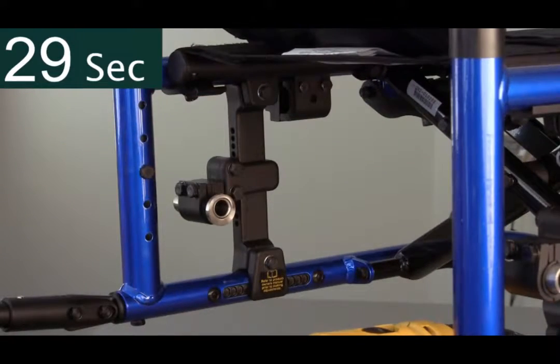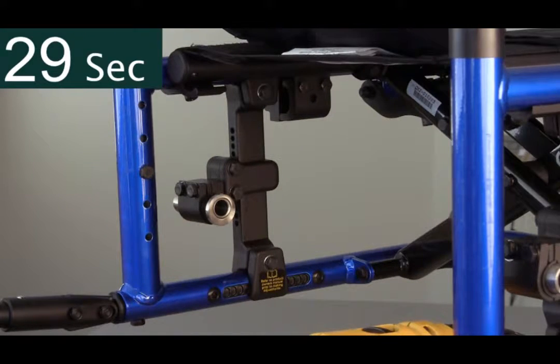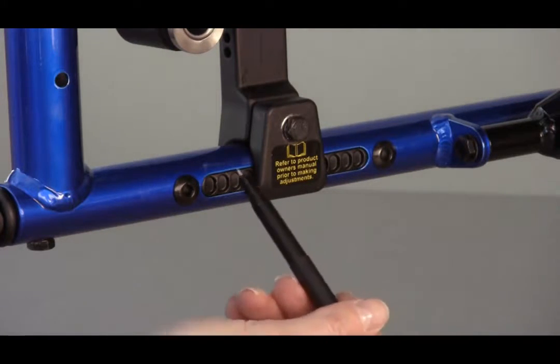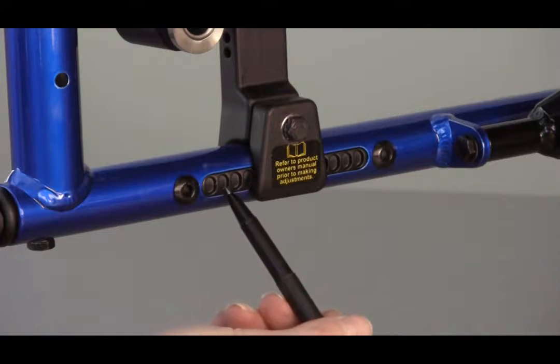It is important to always do the final tighten with the torque wrench to ensure proper tension. Consult the owner's manual for torque specifications. To ensure the other side is moved to an identical position, count the indexed holes behind the axle plate.